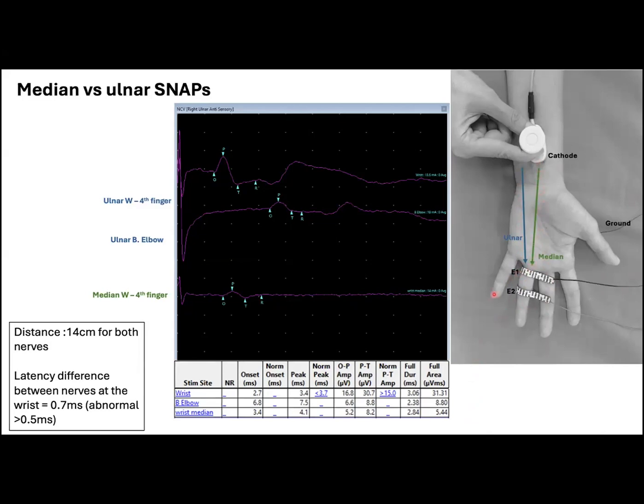In this antidromic comparison, the median snap recorded at the ring finger is not only smaller, but also has prolonged latencies when compared to the ulnar nerve, as you can see here in the picture.